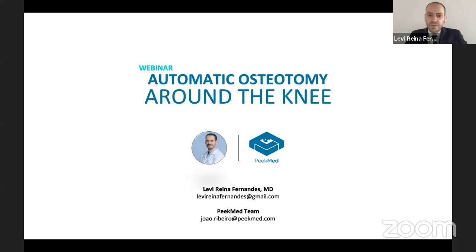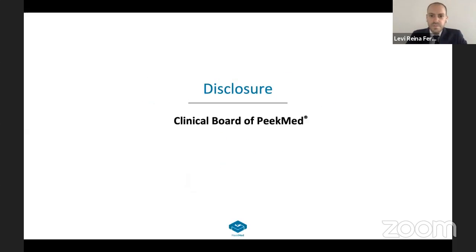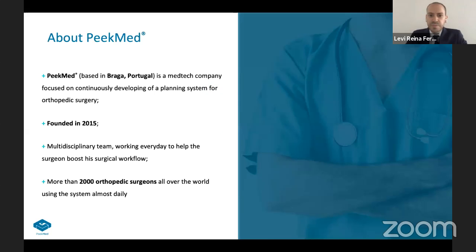Okay, thank you so much for the introduction. I'm a dedicated knee surgeon with a special interest in osteotomy around the knee. And together with Peekmed, we developed an automatic osteotomy tool that brought us here today. So just a little bit about Peekmed.